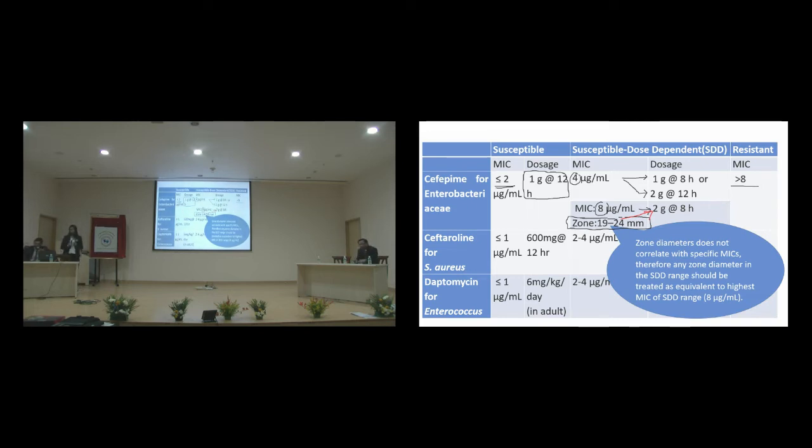If you're reporting SDD, then you have to write a bottom line that this is the recommended dose that has to be given. For cefepime, people who are doing VITEK also, you can see the SDD dose will come. So along with that VITEK report, it is better to add a comment telling what dose is recommended if it is 8, and what dose is recommended if it is 4. So basically, it is correlating with the clinical response.